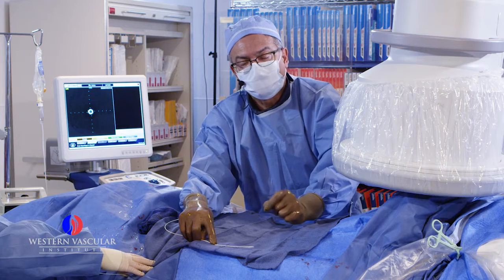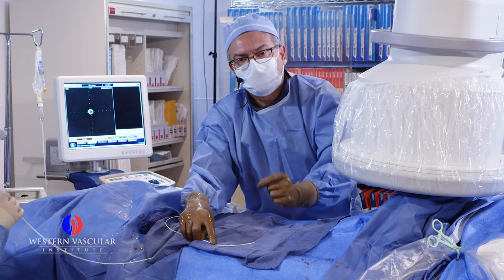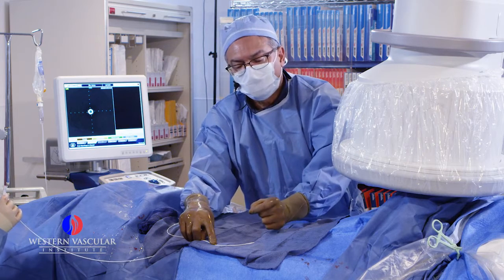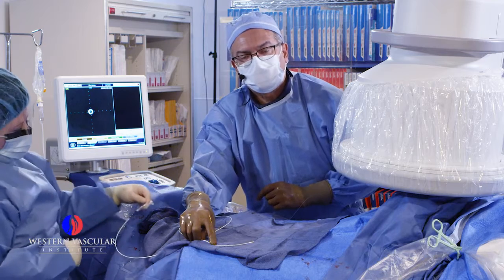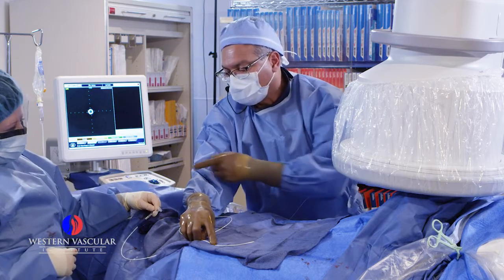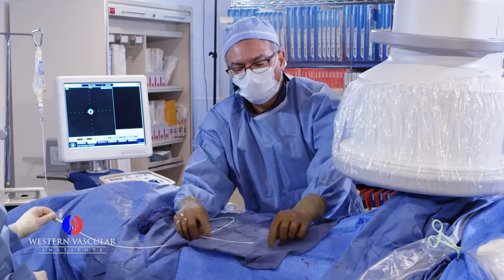It has a mechanism in which you have to pull a string to uncover a very thin layer of membrane that is maintaining the stent in that collapsed mode. Once we get into the target, we're going to pull the string. I will show you that, and that will start deploying the stent, as you will see on camera.